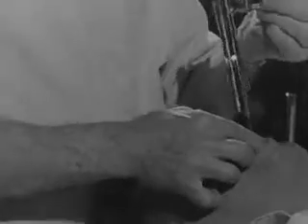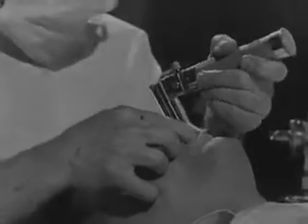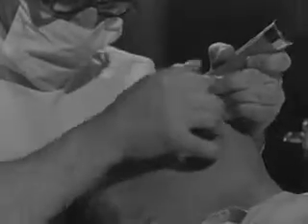Remove the airway and place the folded piece of adhesive plaster over the edges of the upper teeth to prevent them from being damaged by the laryngoscope. The lips and teeth are separated with the fingers and the laryngoscope is passed between them along the dorsum of the tongue. From now on, the course of the laryngoscope must be followed by constantly looking through the instrument.